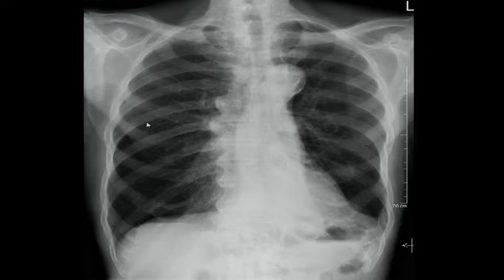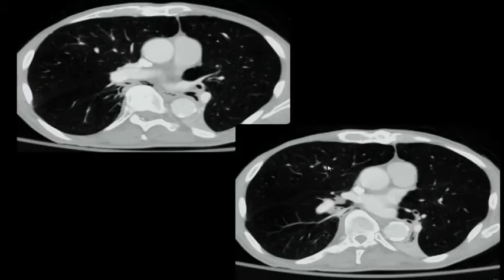Atifa, do you see that triangular shaped shadow? This is the heart border, right? Left heart border is formed by what? Left aortic arch, then left atrial appendage, and then left ventricle, right? Correct. So what is this triangular shaped structure? It doesn't belong here. That's left lower lobe atelectasis, right? You see that? Left lower lobe atelectasis.